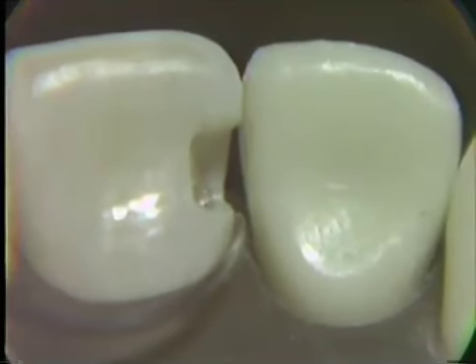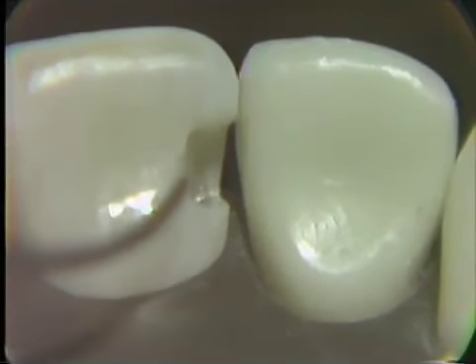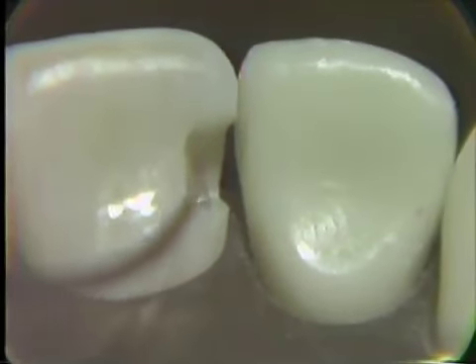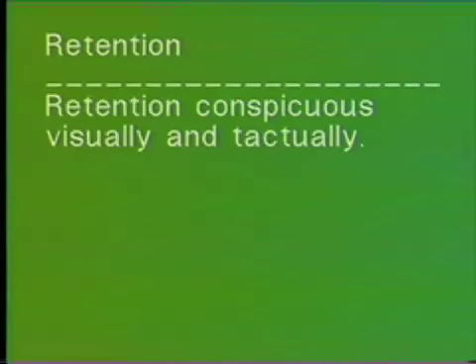You see the outline of the cervical and the labial margins here, as well as the lingual margin. The cavity wall has definition to it. There's crispness to the preparation. The retention should be conspicuous visually and tactilely.